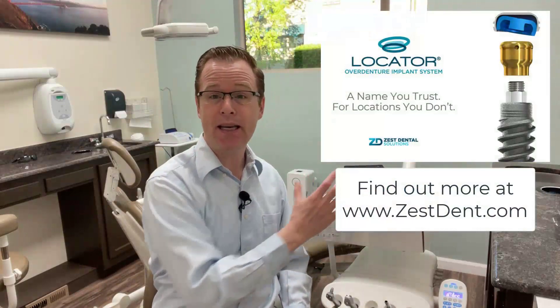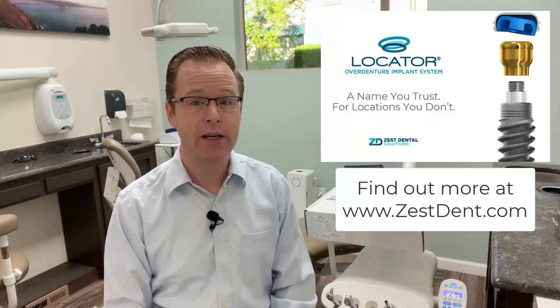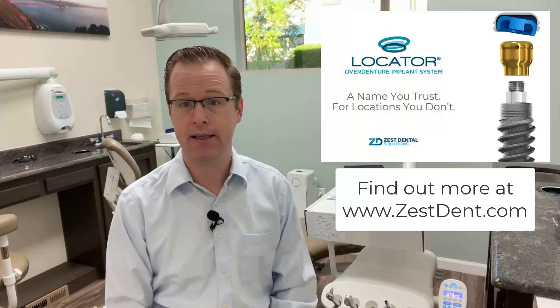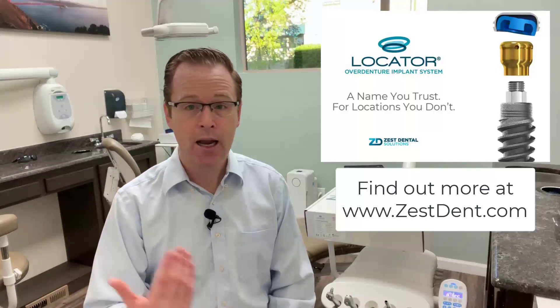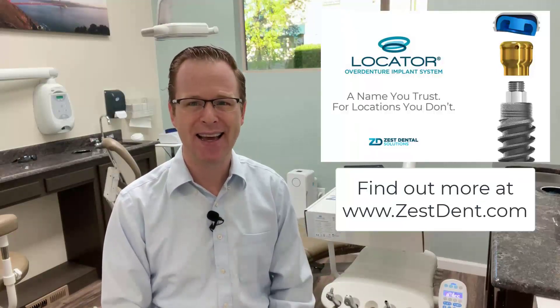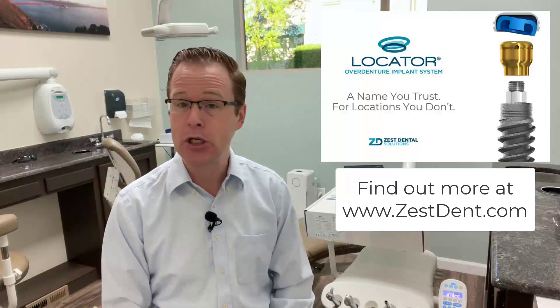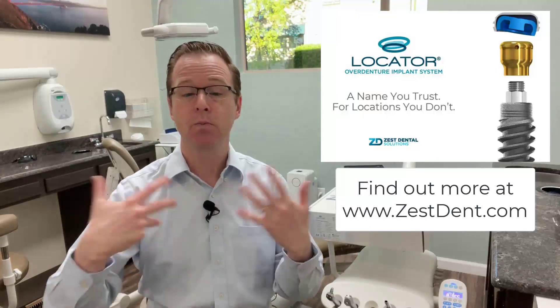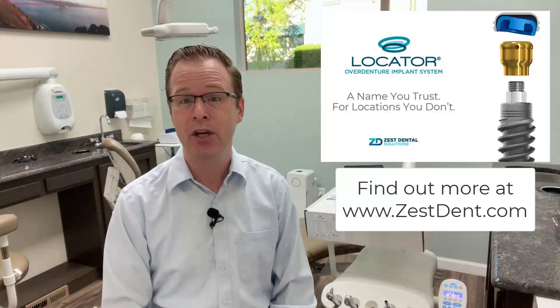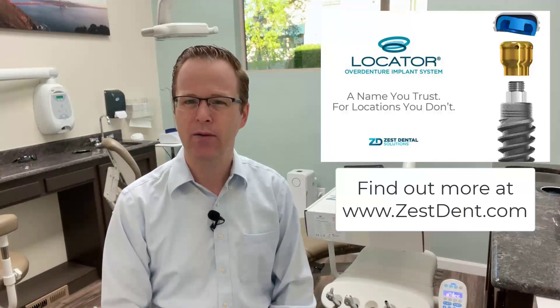I'm super excited about the new expanded or extended range Locator Overdenture Implant System from Zest Dental Solutions. I encourage you to check it out. Let's take a look at the breakdown of the equipment, parts and pieces. This is Dr. Michael Shear with Learn Lodi — I hope this video has been informative in talking about the new expanded and extended range diameter system from Zest Dental Solutions with the Locator Overdenture Implant System.